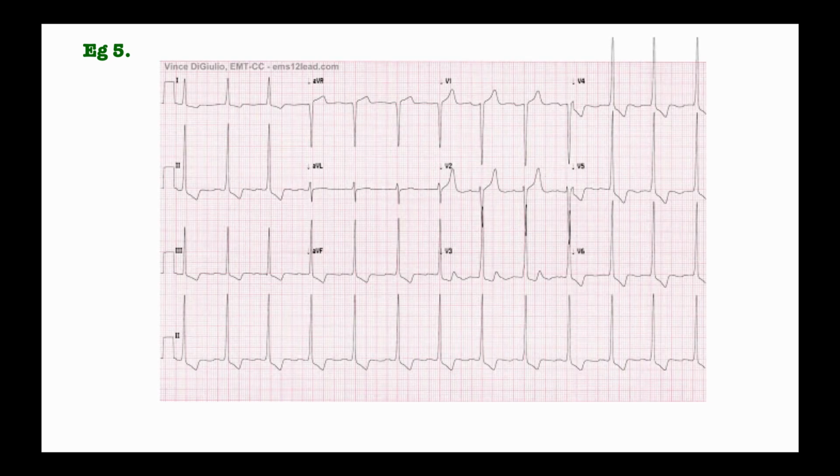I think we have another one. So yeah, over here, you can pause it and try and see if you can get the answer. So here we can use either V5 or V6 plus V1. So what do we get? So let's start: 5, 10, 15, 20, 25, 30, 35. Then we are going to add it to V1.